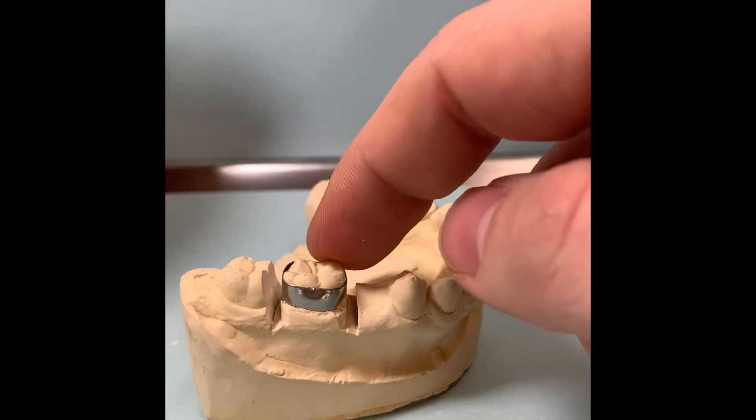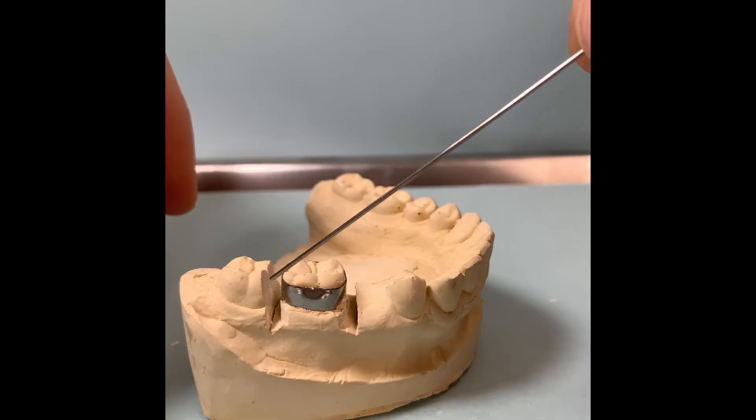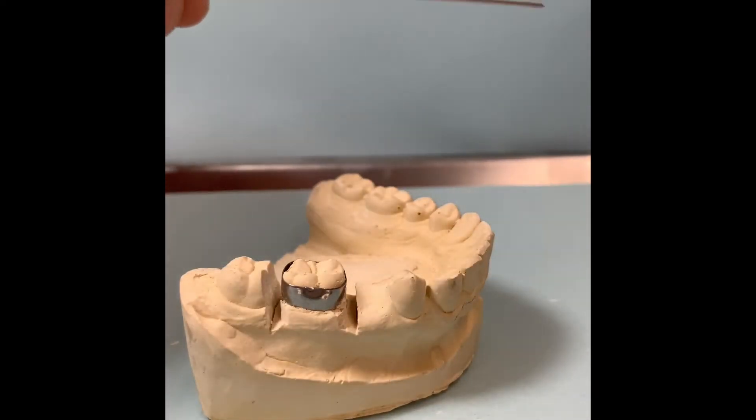I fitted the band already, so this band fits on this patient. I had to sore out a little bit on each side to make sure I fit the band, because the model was not poured with a band.